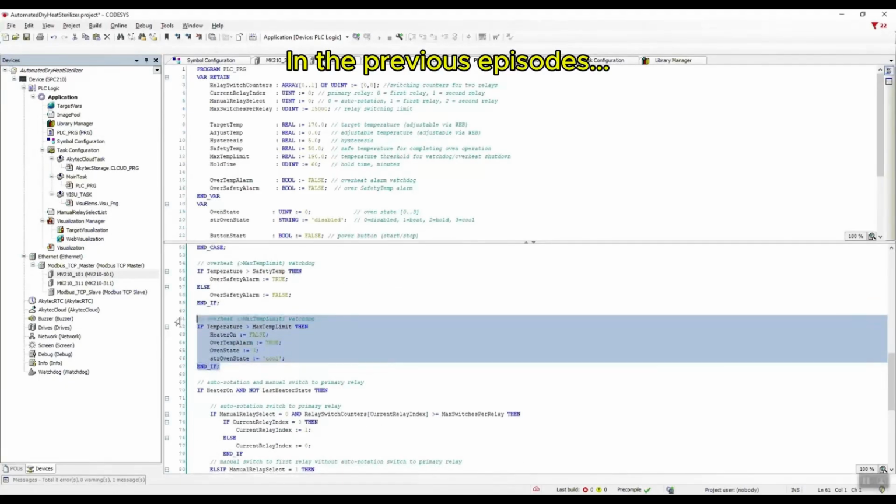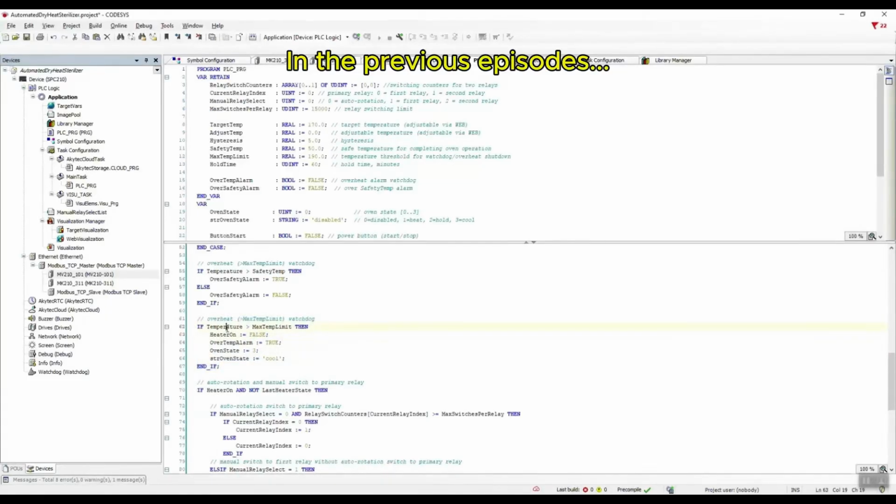The next block of conditions is about improving our prototype. In the event that the current temperature happens to exceed the maximum temperature limit set at 190 degrees, we will immediately turn off the heating element and switch the sterilizer over to cooling mode. We also set the alarm variable to true, which we then send directly to the akYtec service.